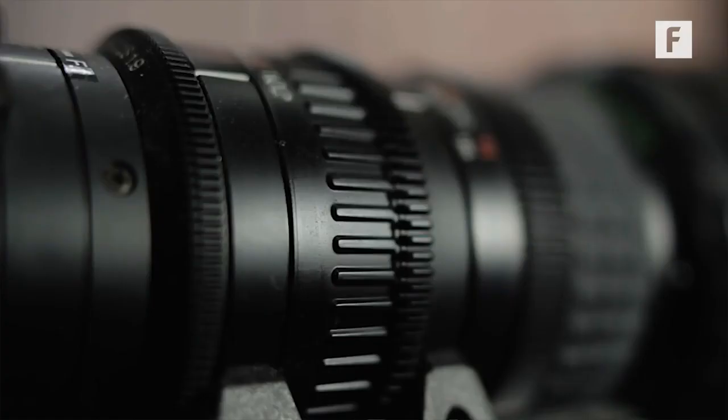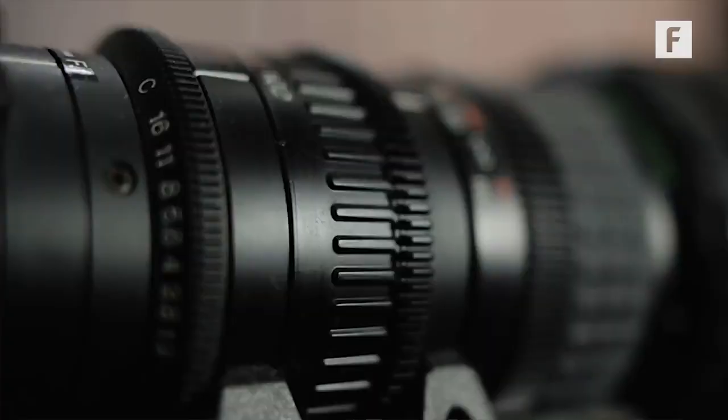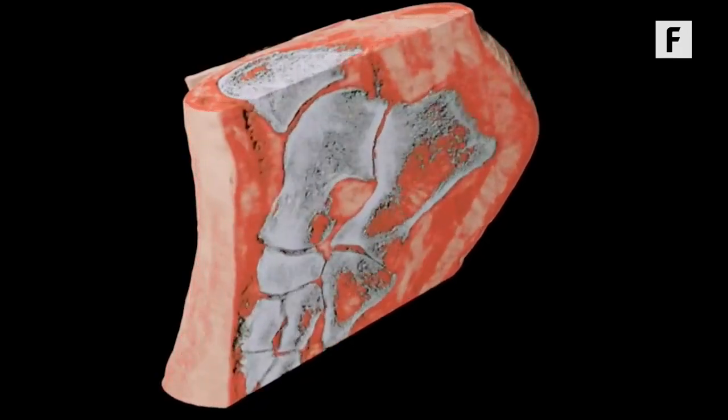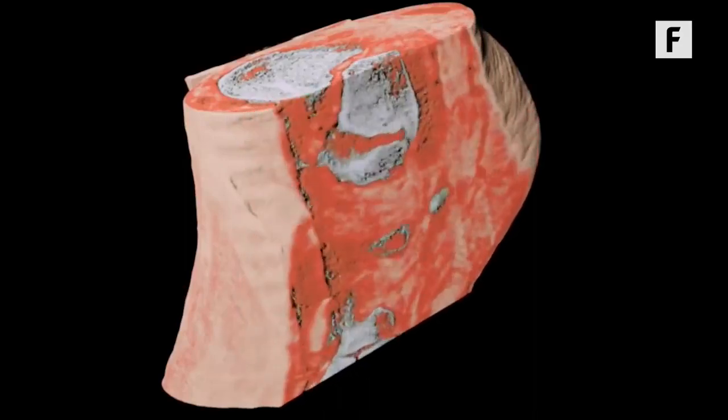Now, how does this Superman camera work? Well, when the shutter is open, it registers the placement and identities of different subatomic particles. And then with the help of a handy algorithm, each material is assigned a color based on the wavelength as X-rays pass through the body. That gives us videos just like this human ankle.